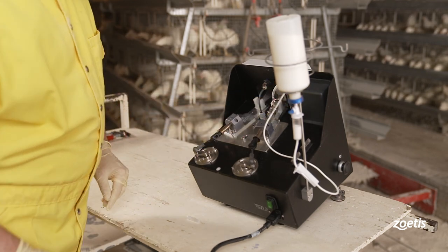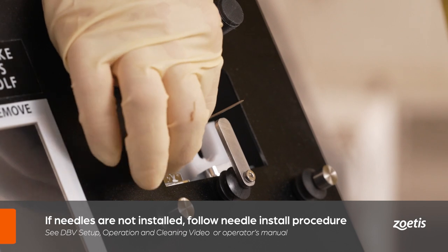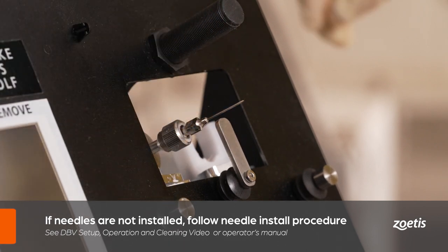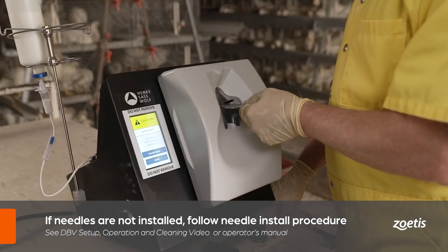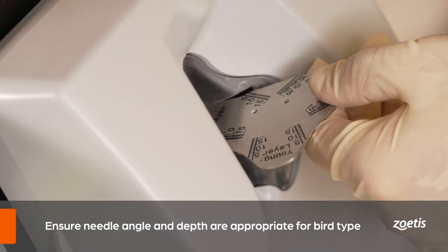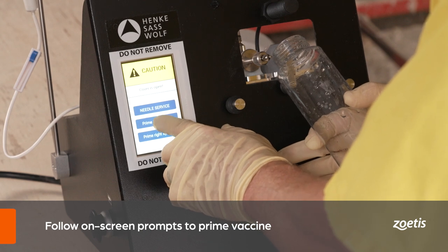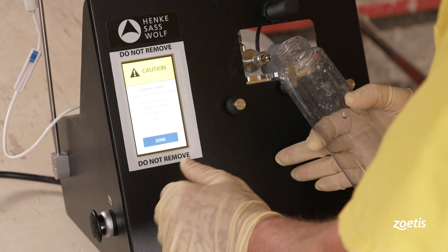When using two different vaccines, pay careful attention to the syringe and tubing so the correct vaccine is delivered to the right location on the breast. If needles are not in place, refer to the needle install process in the double breast vaccinator setup, operation, and cleaning video and DBV manual for detailed instructions. Make sure the needle angle and depth are appropriate for the type of bird.